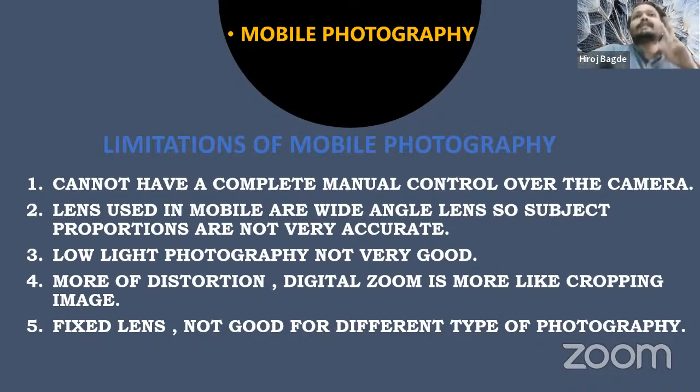First of all, second is the light system, which we talked about in cases of dental photography. Even that is developed. There are many companies manufacturing the lights, not presently in India, but they have a twin light system for mobiles also. So this smile light MDP, we have many kinds of dentists, I'll not call them scientists, they are dentists, working on this twin flash system.